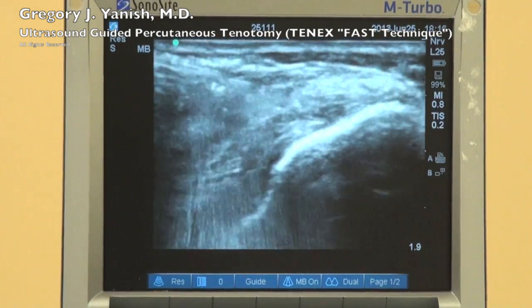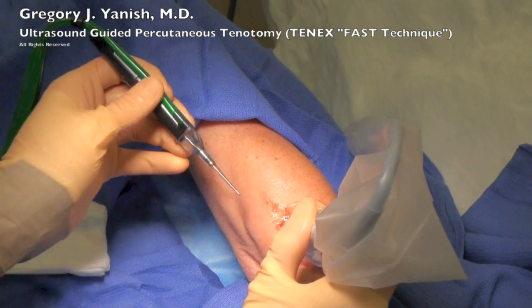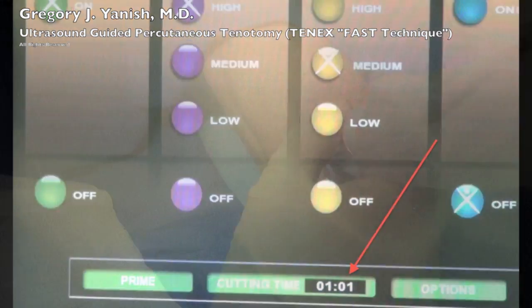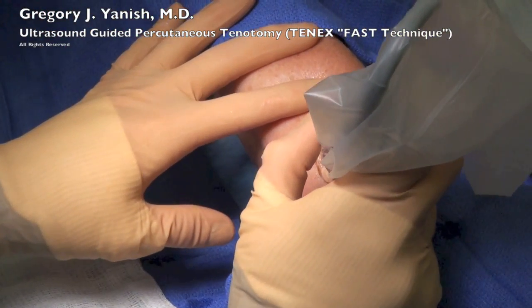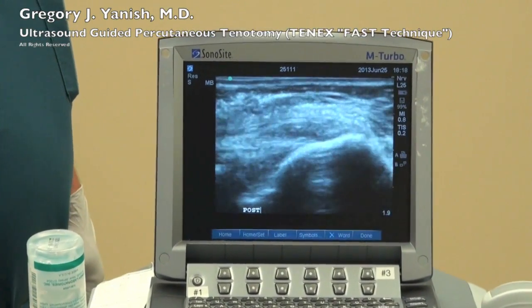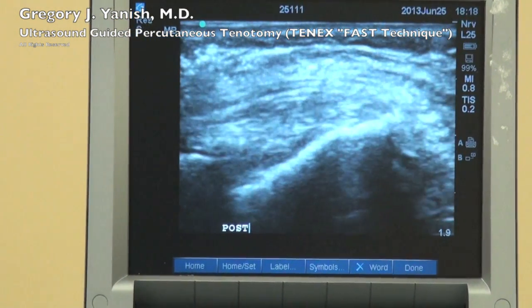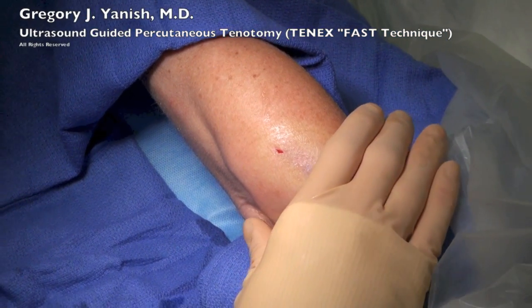You can see it's being removed very effectively here. At this point I feel satisfied and we'll go back and take a review — I've used one minute and one second of cutting time. We'll take one final look with the ultrasound, getting a good visualization of the area that has been worked on. The area that was once visualized as dark black or hypoechoic is nearly completely removed. There's a very small shadow remaining and you can see that the tear has been very effectively removed.